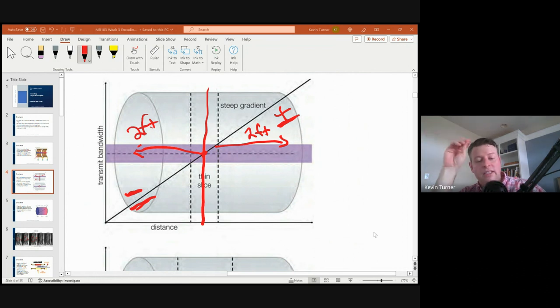Not the fringe field, because the fringe field is talking about the main magnetic field. We're not talking about the fringe field, because that would only come from the main magnetic field. And we consider that in safety options, which we usually talk about when the gradients are turned off. Isocenter is the best place to scan, the middle of the gradients. And when you lay a patient down and put these little laser lights on the patient, you're marking the patient so they move to isocenter, because ideally, that's where you want to scan the patient. All right.